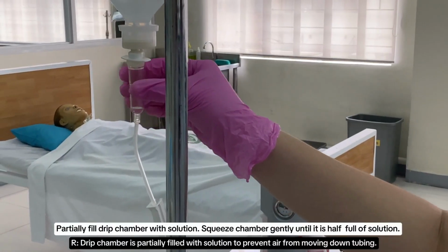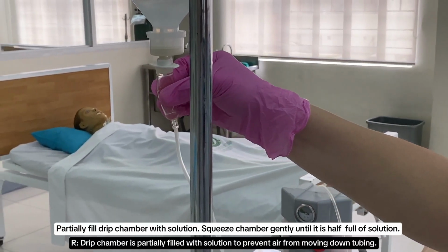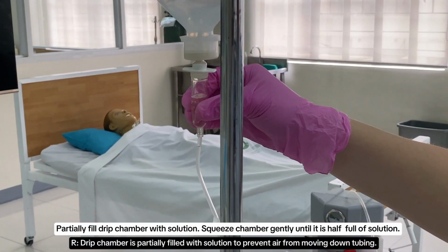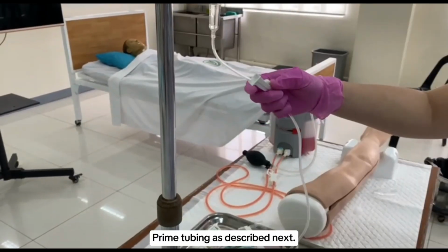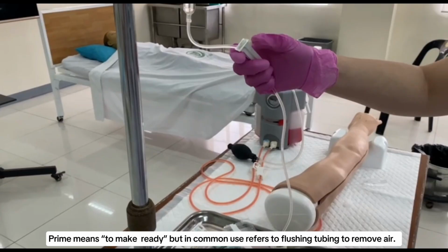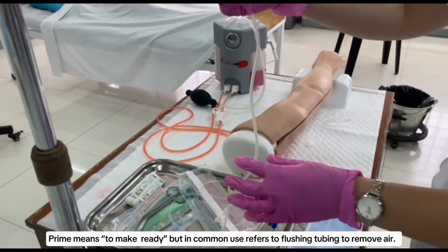Partially fill the drip chamber with solution. Then, squeeze the chamber gently until it is half full of solutions. The drip chamber is partially filled with solution to prevent air from moving down the tubing. Prime tubing as described. Prime means to make ready, but in common use refers to flushing tubing to remove air.